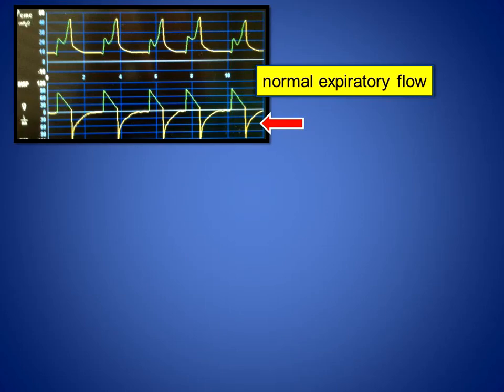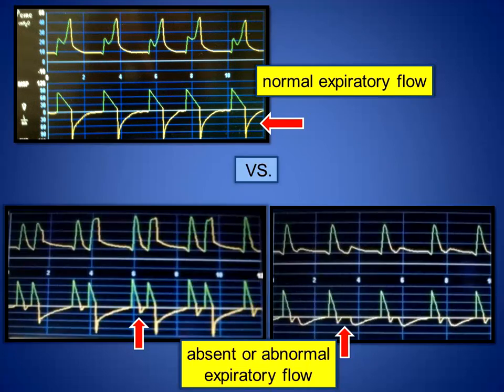I'm going to do this last slide, and then we'll cut it off here, because I've presented 2 different decreases in airway pressure, and I find that they're very confusing. This is up at the top an inadequate flow, and this down at the bottom, what I have pictured for you is a cycle asynchrony. So you have a problem on the front of the breath versus a problem on the back of the breath, both of which decrease airway pressure.